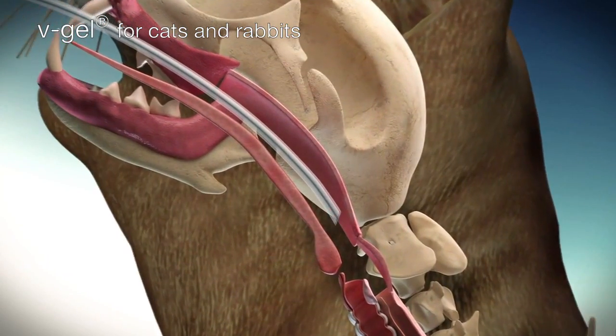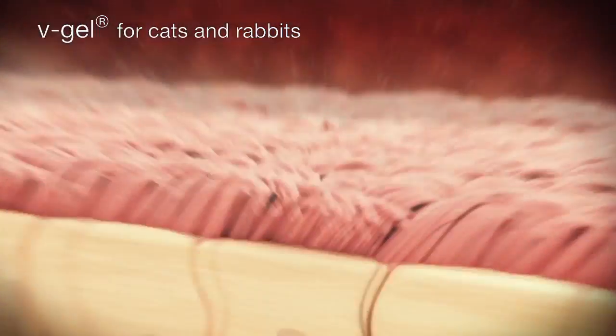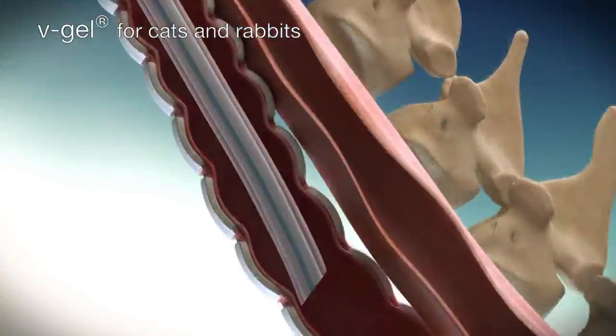This damage happens as a result of the tube contacting the extremely fragile surface of the tracheal epithelium and is not something that can be mitigated by improving intubation technique.